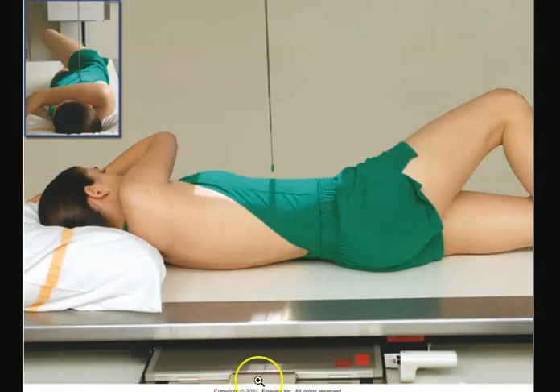Again, now we have our table bucky, and you can't see the handle in this picture, but what we do is we pull this tray out. We put our IR, which is indicated here by this gray piece right here. We put our IR in there, and in this case now we have a marker too that we're looking at. The technologist put a right or R marker here because this is her right side. So this will show up on the X-ray on her right side so that when we give it to the radiologist, the person that reads these X-rays, they can know, okay, this is her right side. So if they see some pathology on the left side, then they can be sure of it.